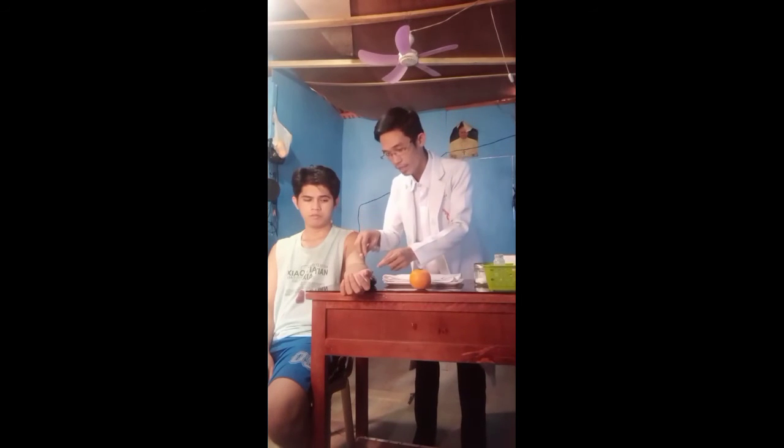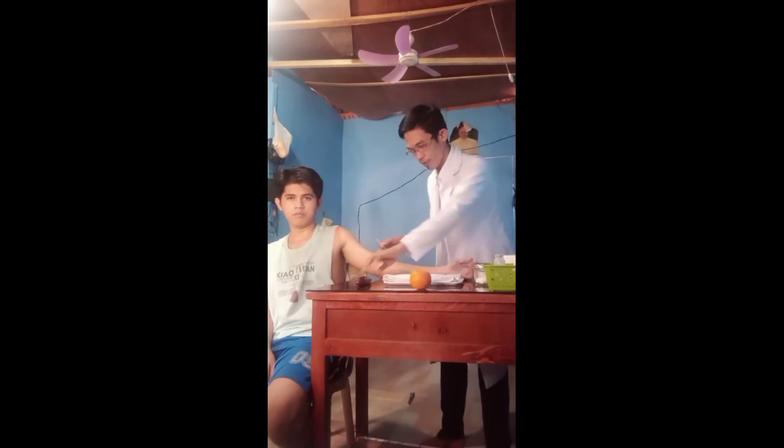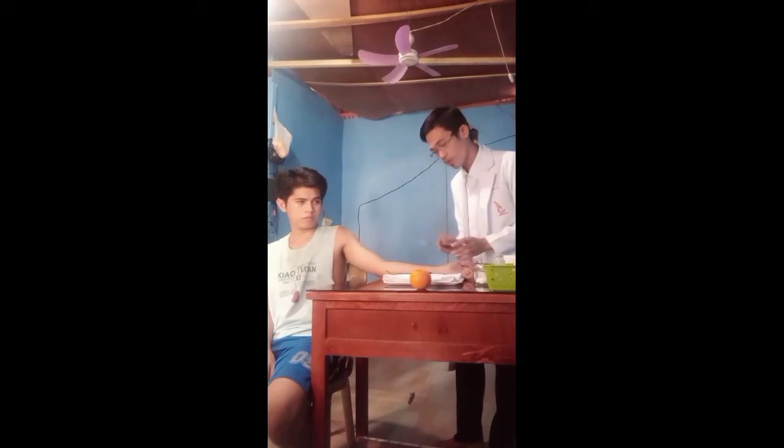So the intradermal, with non-dominant hand stretch skin over site with forefinger or thumb. So needle passes through tight skin more easily. So with needle almost against patient's skin, insert it slowly with bevel up at a 5 to 15 degree angle, which is slant. So doing just like this. 5 to 15 degrees angle.